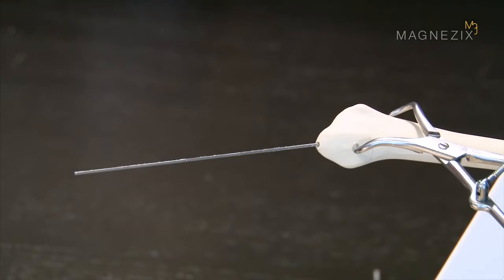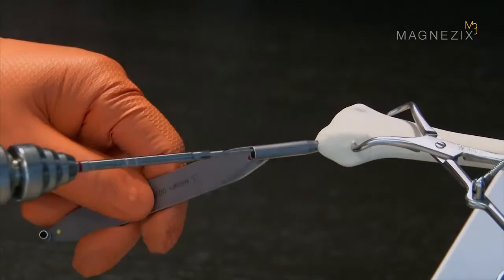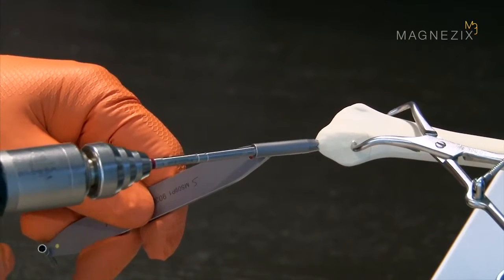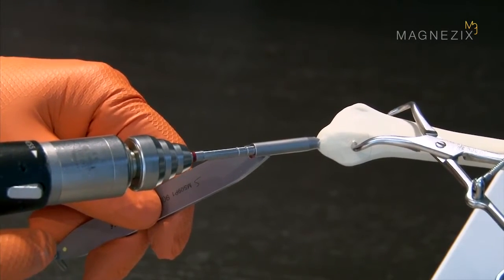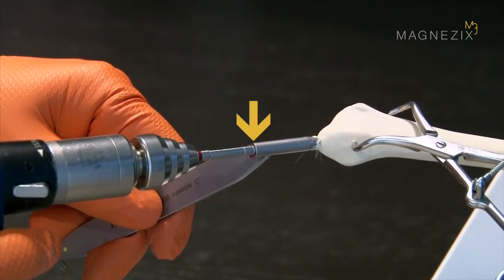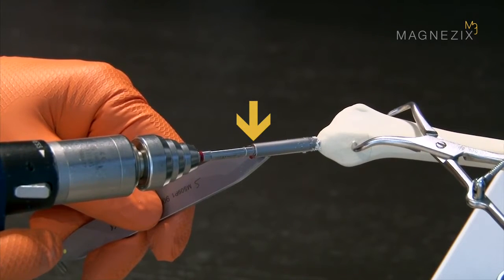To make it easier to insert the screw head, use the countersink to enlarge and bevel the point at which the head of the screw will sit flush with the bone surface, meanwhile making sure that the guide wire is still in place as you do this.